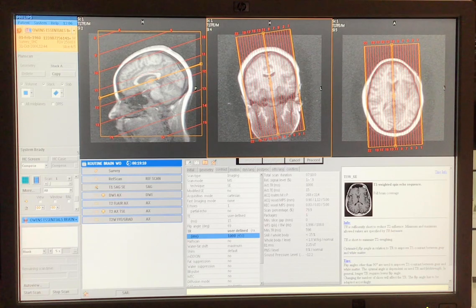Can you please repeat, for a T1 weighted image, the reference for the TR and the TE that we would select? Yes, and I'm also going to upload the preferences for you, okay? Because for a T1 weighted scan, you're gonna want 800 or less TR. For a T1 weighted scan, you want a TE of 30 or less.